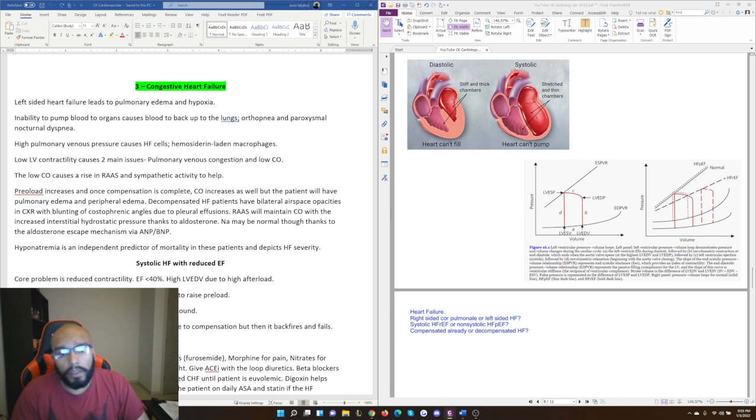The right-sided ECG would better confirm it if you could do one. Bradycardia in the setting of hypotension is also a sign of right ventricular MI, because right ventricular MI often involves ischemic disruption of the AV node or even the SA node possibly. Right ventricular ischemia causes an abrupt decrease in right ventricular contractility, so of course your right ventricular preload will be high. There's a lot of blood that's going to end up staying in the right ventricle. It's not going to get pumped out because the MI messed up the right ventricle's function. Increased pressure is then transmitted back to increase your right atrial pressure and the central venous pressure.